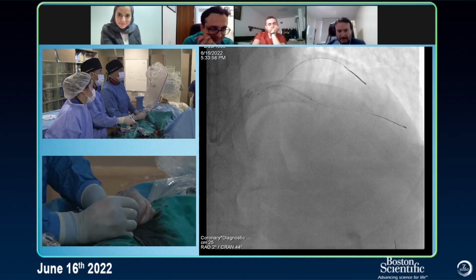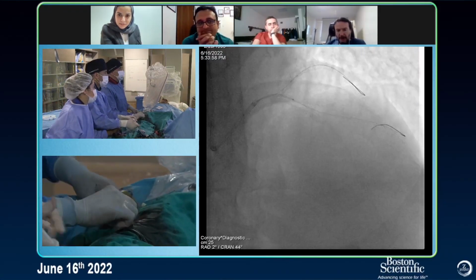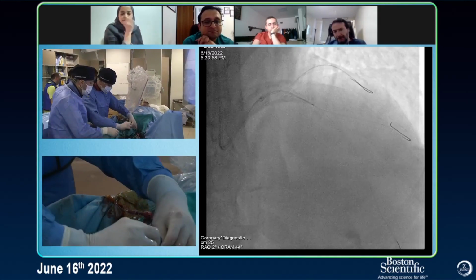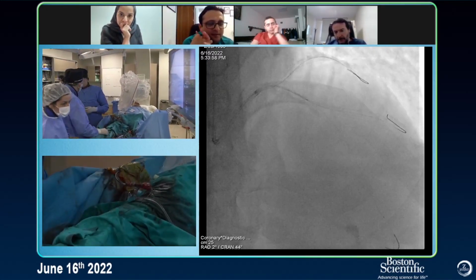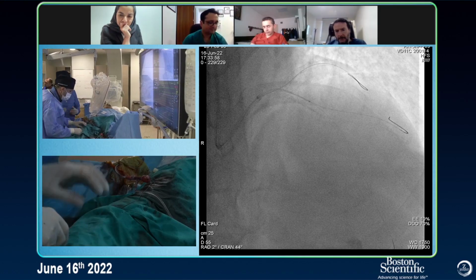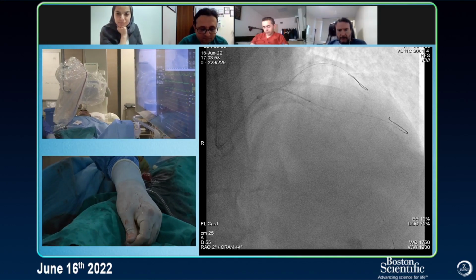I mean, you need the guide liner or an anchoring balloon. Anchoring balloon would be better. Okay, 3.5 short balloon. If you have a standard segment in your circs, maybe put your balloon there. 3.5, 12. Okay, let's do anchoring because I have lots of wire. You know, I have to remove.